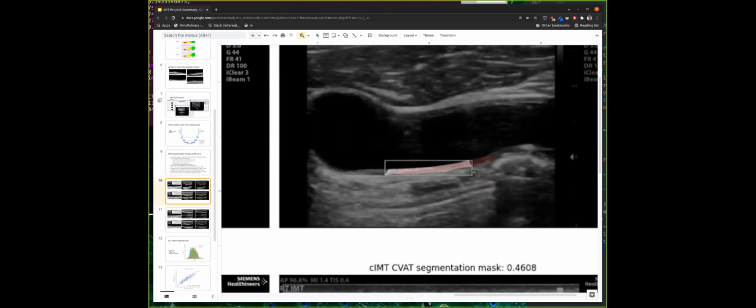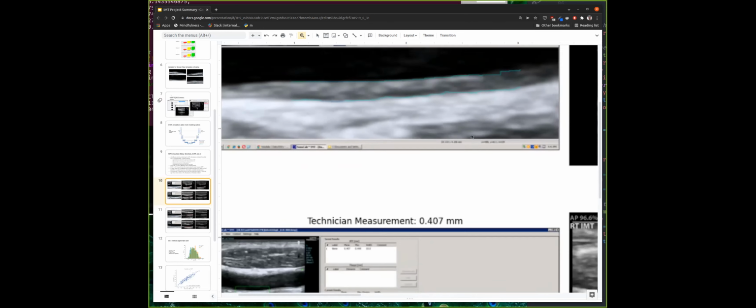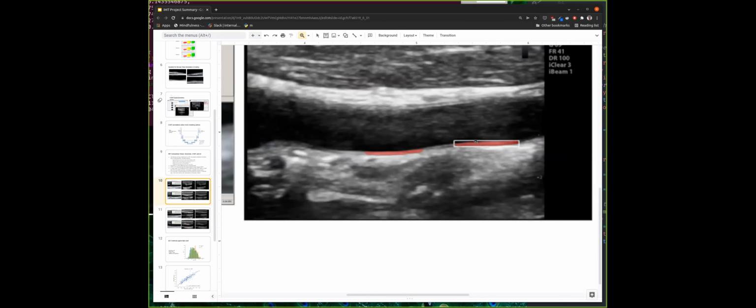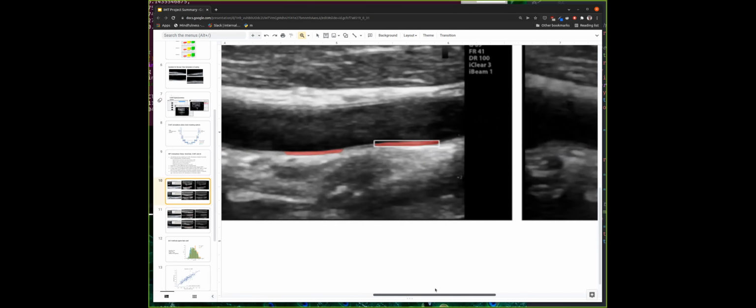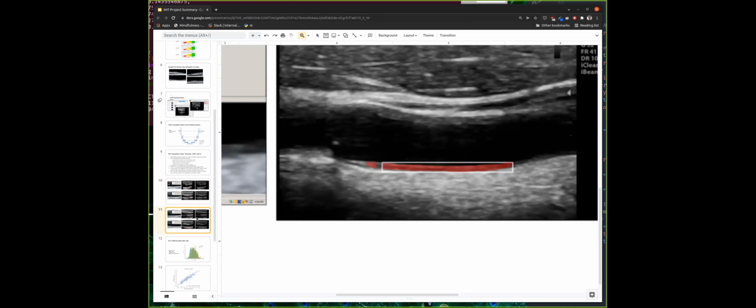If you zoom in on the same one, this SonoCalc region doesn't look very different. Some of them, I guess we'll see, have much bigger jumps that make it a little hard to figure out if the average thickness from something with a lot of jumps is more or less trustworthy from the more modern smooth shapes that you get from these images. Yeah, good point. But anyway, I'd say that the neural network version of the model is working really well, and we can begin looking at that on a larger scale and see if that is trustworthy enough to put into production.